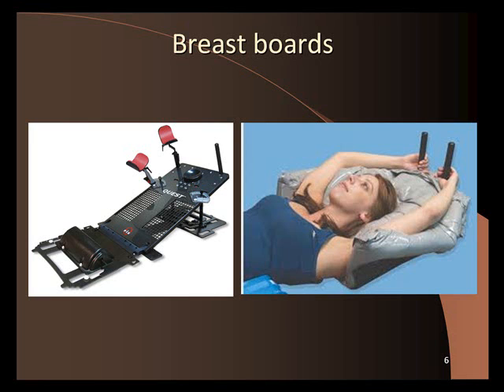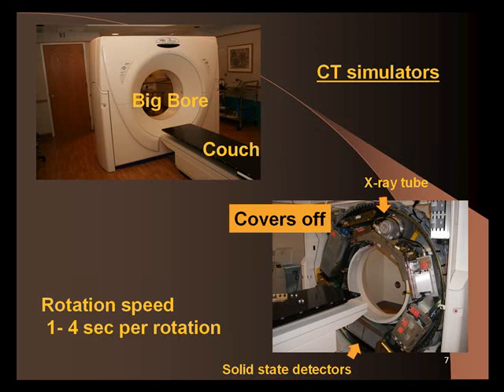Once the foam sets up, it becomes pretty hard, and it's light because it's foam. Okay, so it's light, you can carry it easily, and it forms. It usually does a better job forming around a patient than the vac lock, but it can get really messy. If you spill this stuff, it doesn't come off. I mean, if you spill it on the table, it won't come off. You'll be able to scrape the big stuff off, but it leaves a stain. So it's messy, but it forms really well. And it might be more expensive in the long run because you have to keep buying this material. With the vac lock, you just reuse them. Okay.